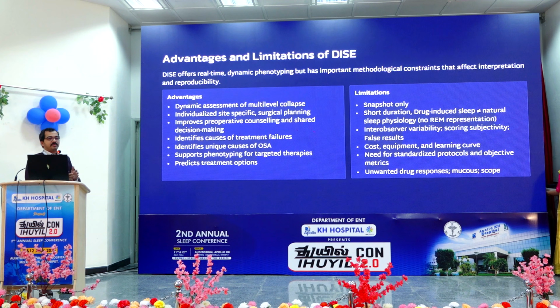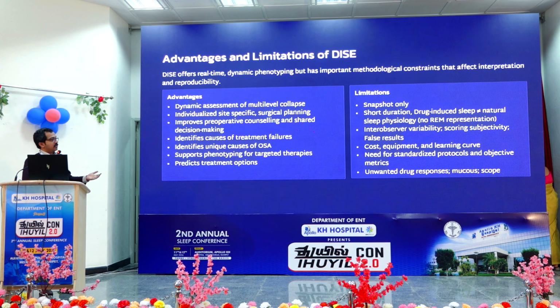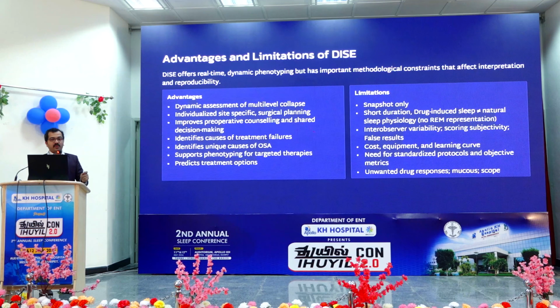A circumferential collapse may not appear as a circumferential collapse for a second person. And there may be scoring subjectivity. For one doctor it may be partial, and for another one it may be a complete collapse. False result: if you sedate the patient more, there will be more collapse. If you sedate less, all the muscle tones will be there, so there may be less collapse.